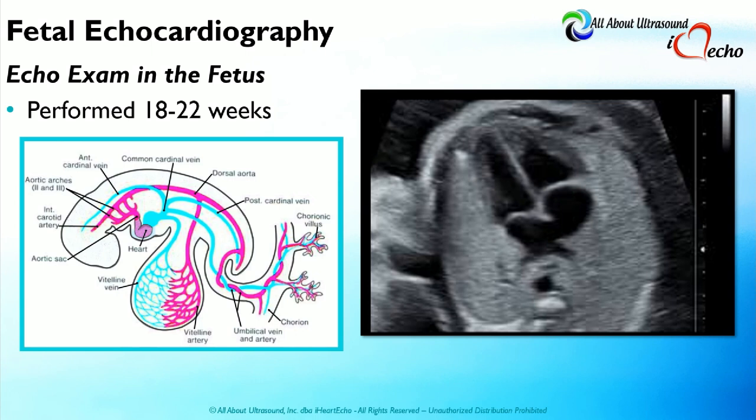But when you start to get into pediatrics and into fetal echo, those ranges are highly variable based on age and based on the different populations. And so, it's hard to have just a set range that this is what your normal value should be all the time. So, Z scores were created as a method to be able to determine what is normal and what is not.